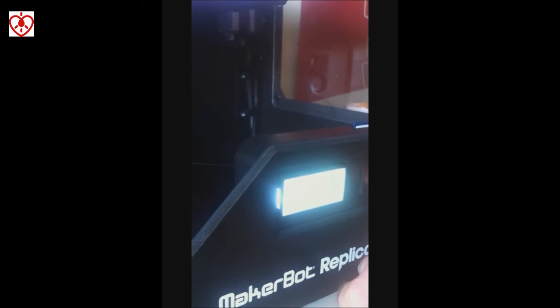Now that we've started to print and the first couple of layers are done, we're going to go into the LCD menu and turn on the fan that Salome and I added. Fan on — and now the fan that's on the front of the extruder block. And it's working!